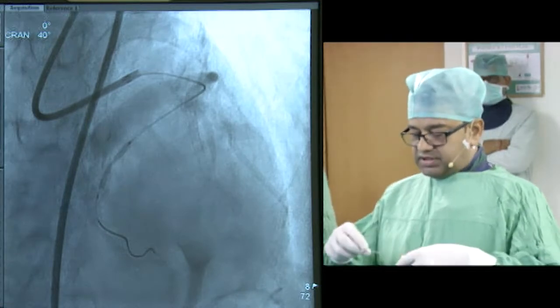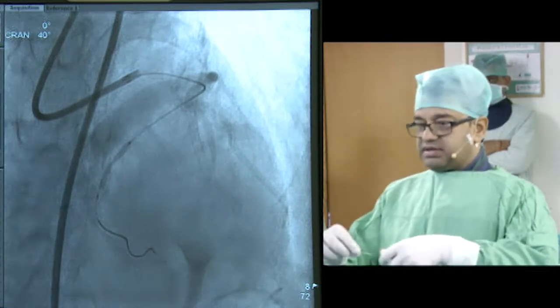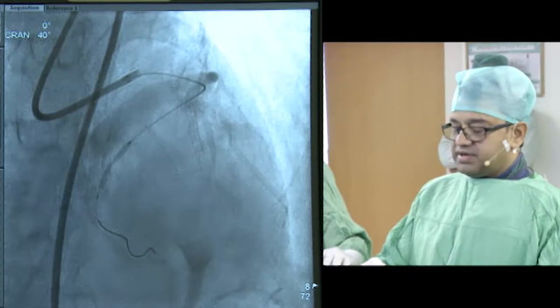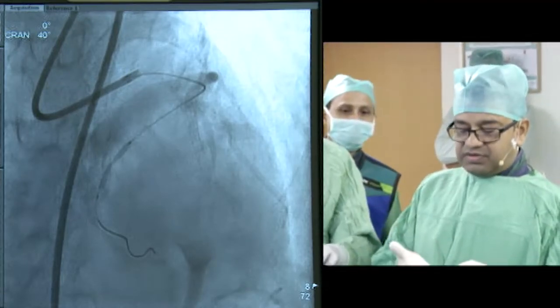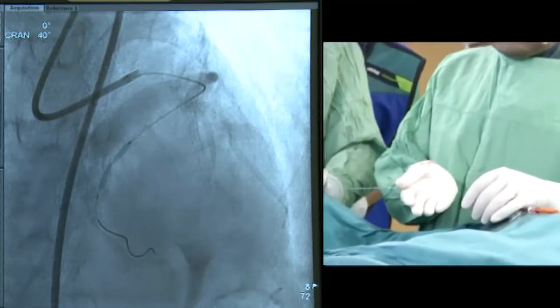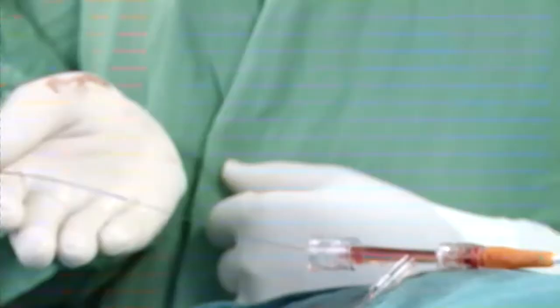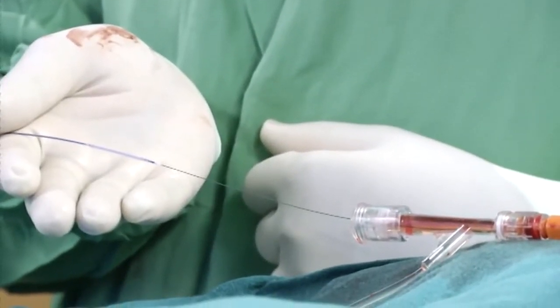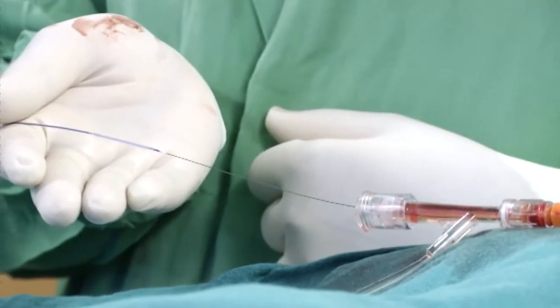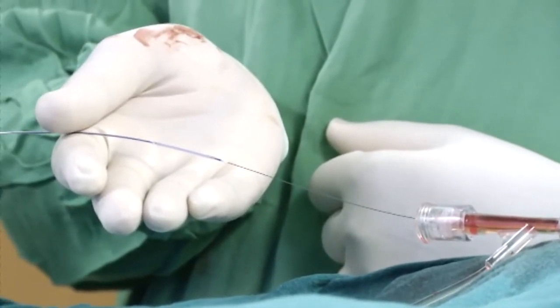That's very exciting. Can you show the Meres stent here? Can you focus on this camera? As you might have heard, in the United States they've removed the Abbott product, but I'm very happy to see that Meres is doing well with very nice data. We see your stent.